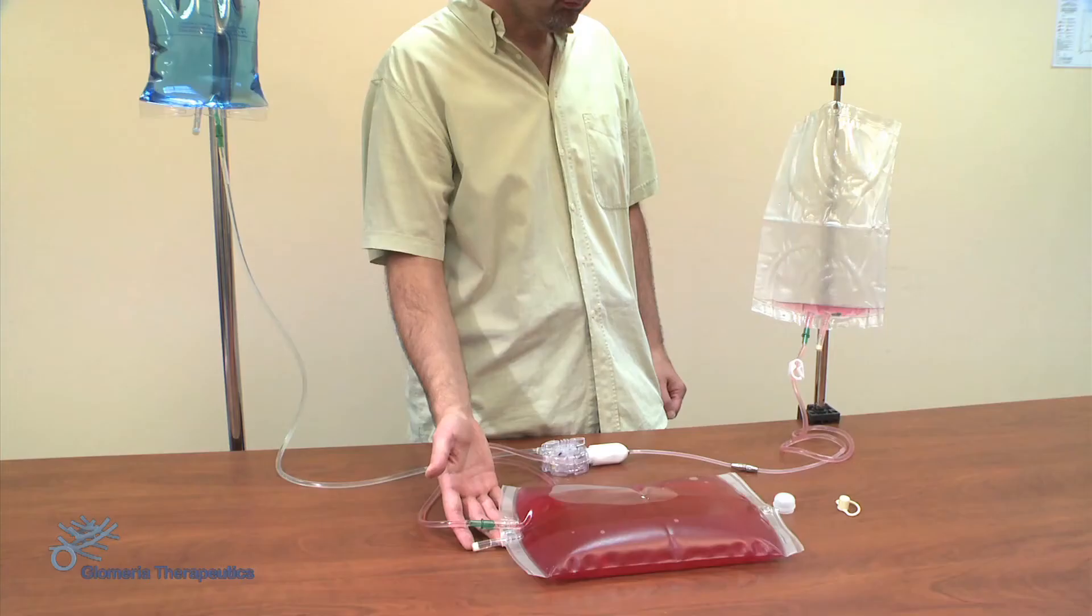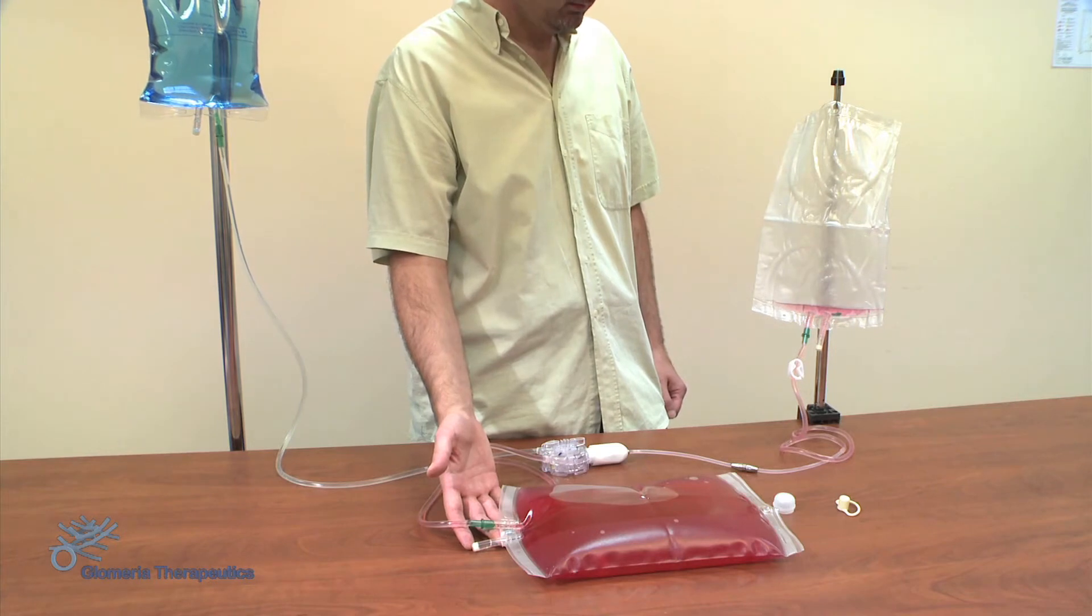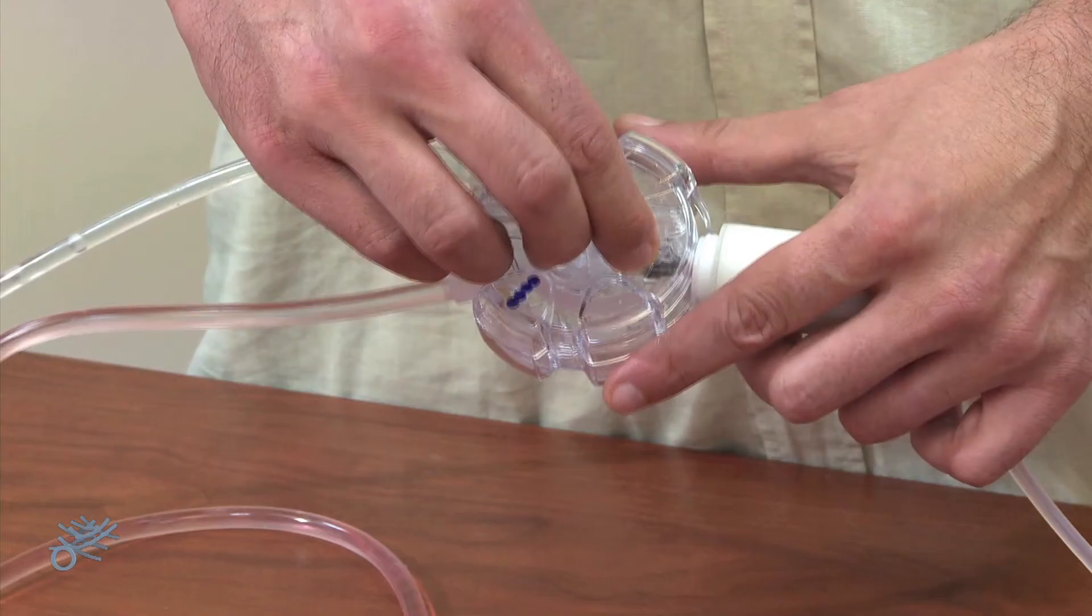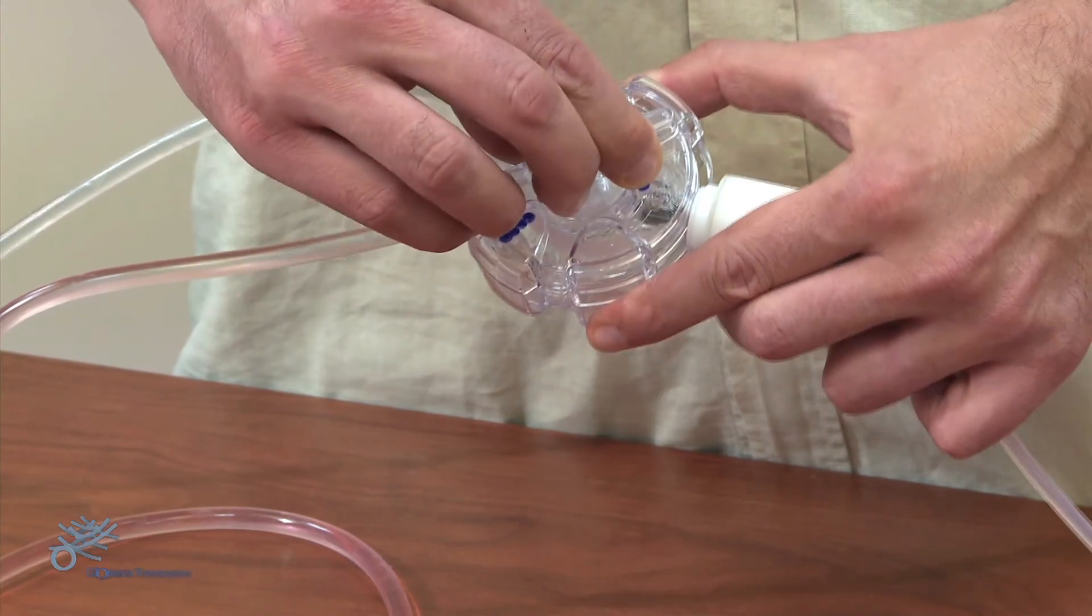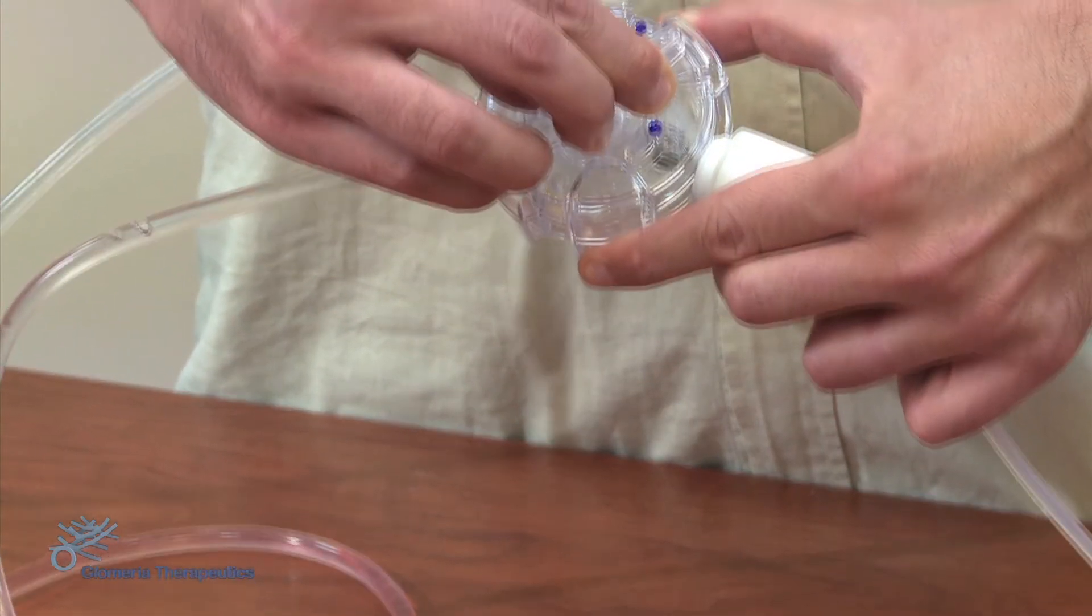When the liquid present in the peritoneum has filled the receptacle bag and the flow has ended, we turn the valve on the Desmo connector to the position denoted by three blue circles.